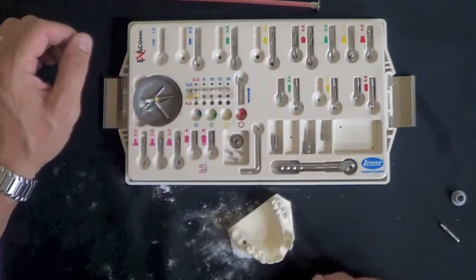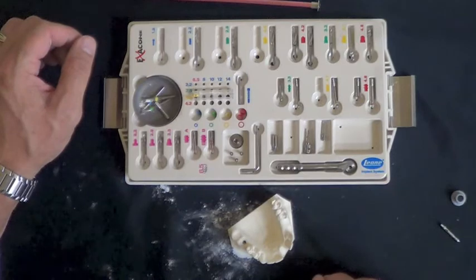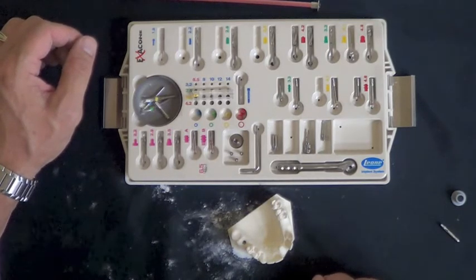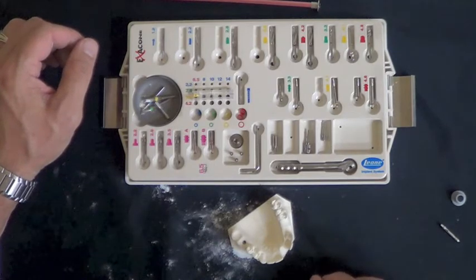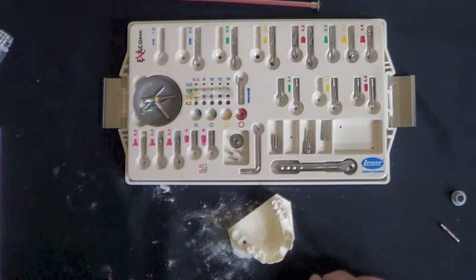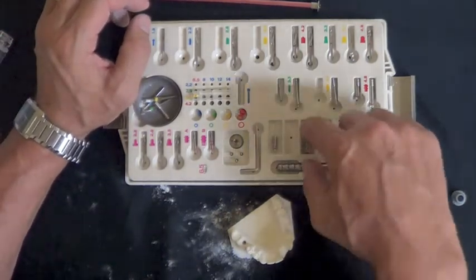Once the implant is placed, you have two choices at that point. You can do a single stage surgery and place the healing cap. Or you can place the cover screw that came with the implant packaging. If you want to place the cover screw and do a two stage surgery, the instrument to place the cover cap is located here.